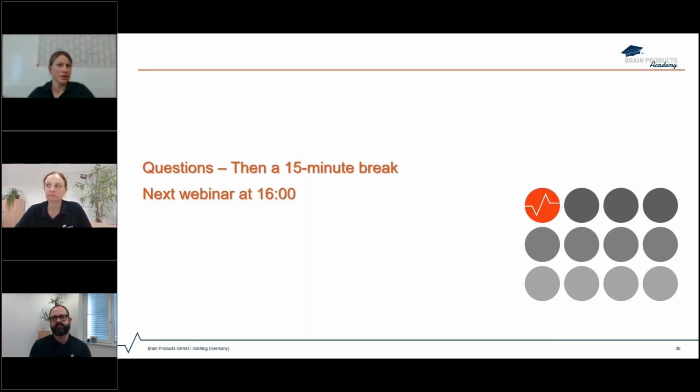For example, I mentioned you can remove the cardioballistic artifact by using information from the ECG signal. This is a very semi-automated process because the ECG signal itself is a kind of physiological signal that fluctuates or varies within our scanning session. So it's hard to automate that with some kind of mathematical transformation.